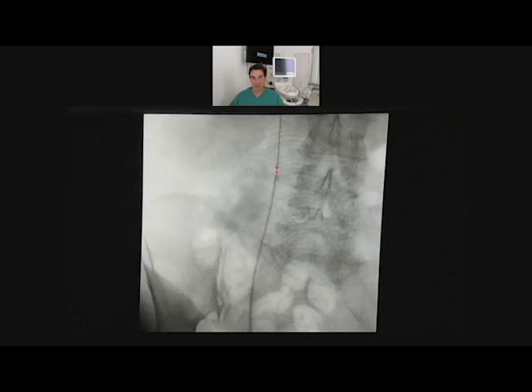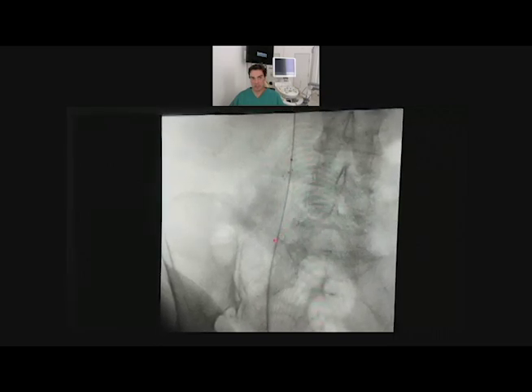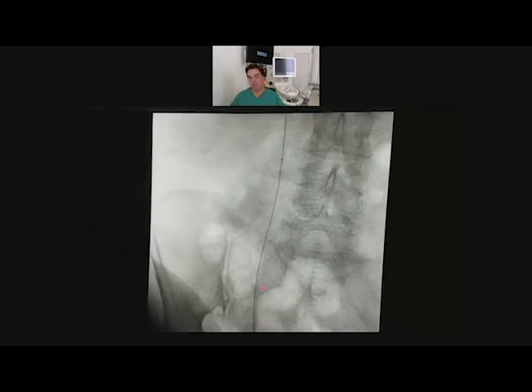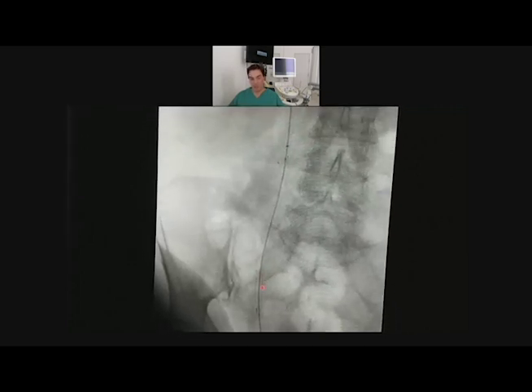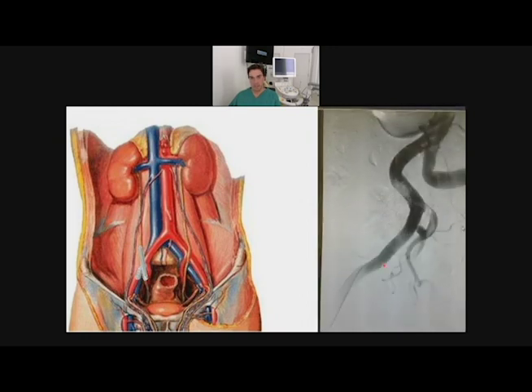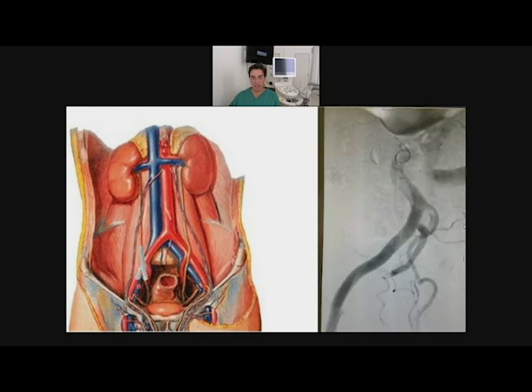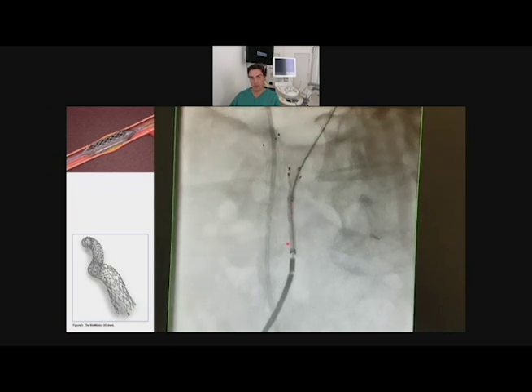This was the end, what I call the tip. I open it now, you see it coming. It is pressing against the wall of the ureter, and in the same moment it is closing the fistula of the ureter and also the ureteral arterial fistula. You can see it here really nicely. Also, our vessel surgeons want to secure it from the other side too. We want to do a second stent, but this is from the vessel surgeons. From the other side, they close it then also from this side.